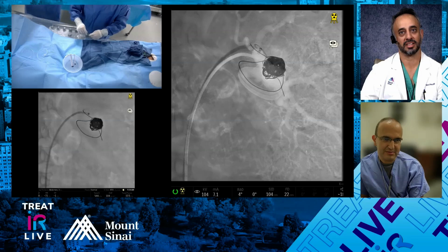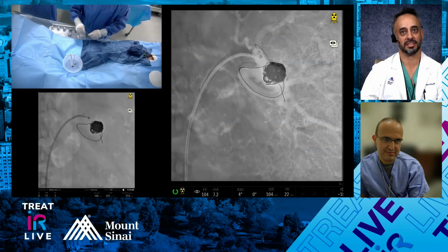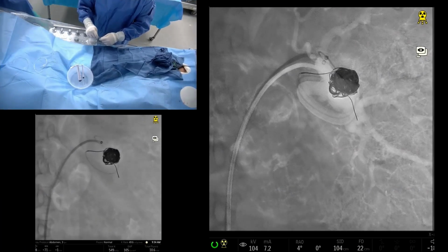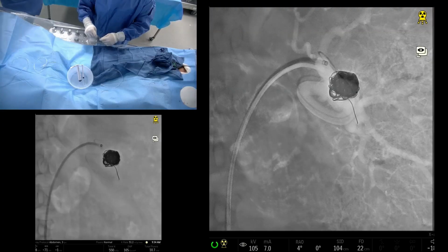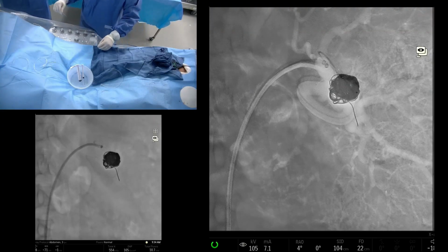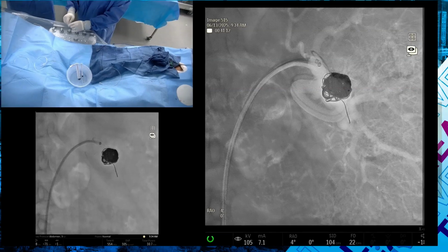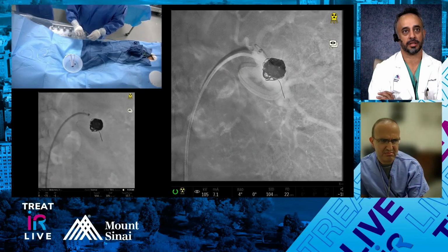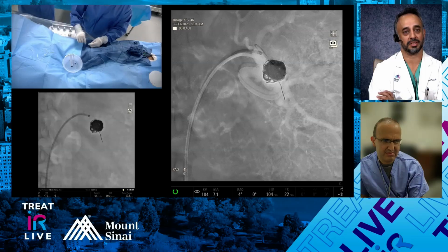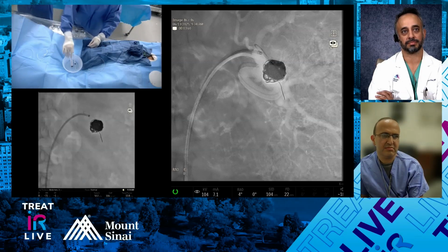All right, so I'm just pushing this 18, then we're going to downsize to a 10 or a 12, and then probably just do the inflow, and we should be done. What's the smallest fiber size that you have? It comes in a 2x4, and then there's also the softs as well.